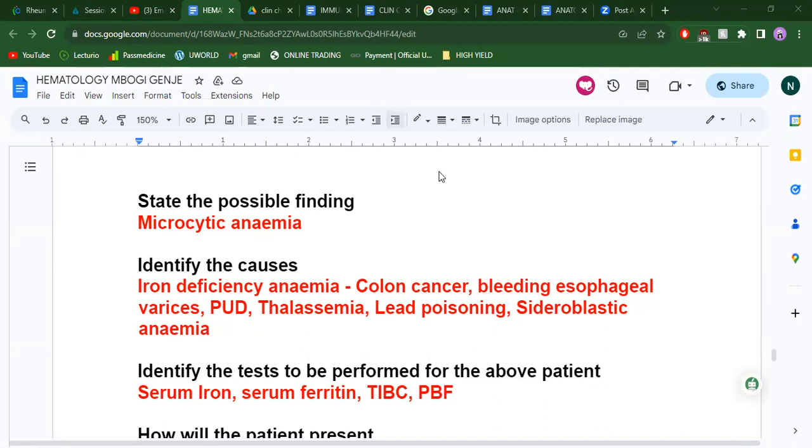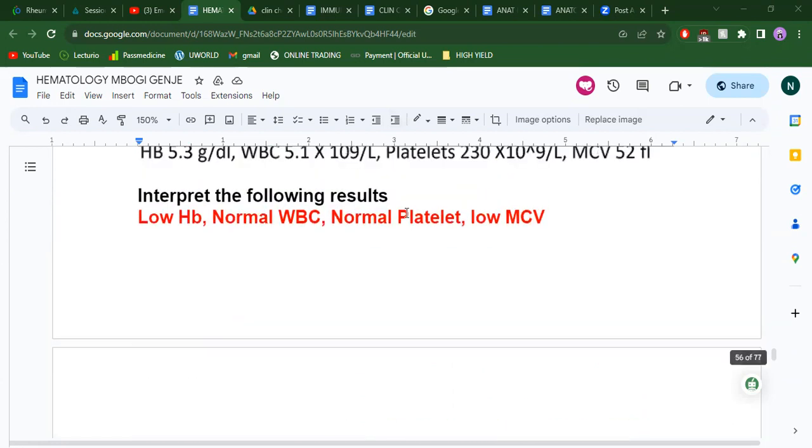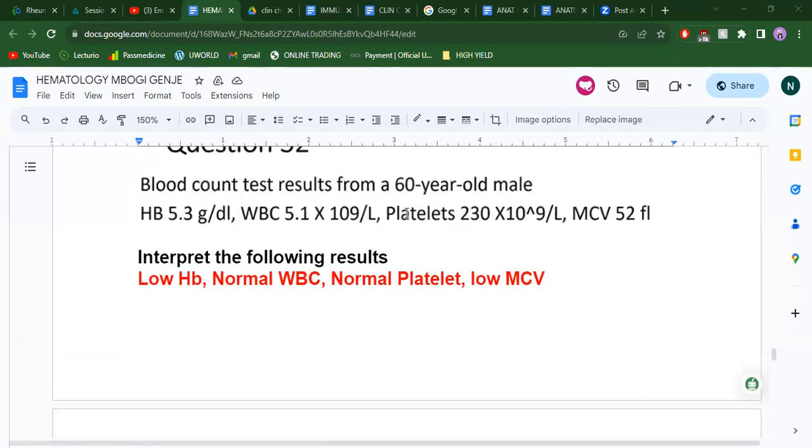I'm seeing a question. So we just ignore the low WBCs. Which low WBCs? The WBCs are normal.